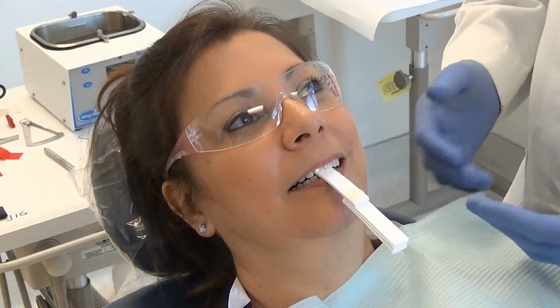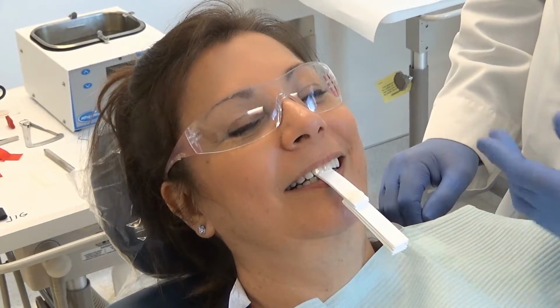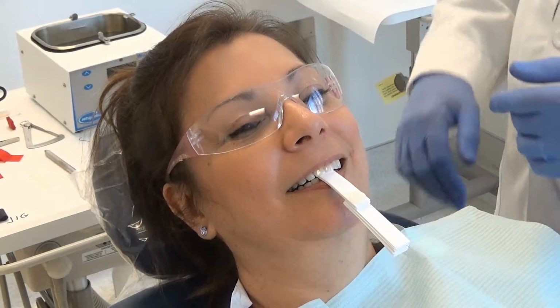Okay, so I'm just going to ask my patient how they're feeling. Do you feel like anything has happened? Mm-hmm. Yeah. Does it feel like the jaw's sliding back? Yes. Okay, so it's been in there 5 minutes now, and the deprogramming has taken place.